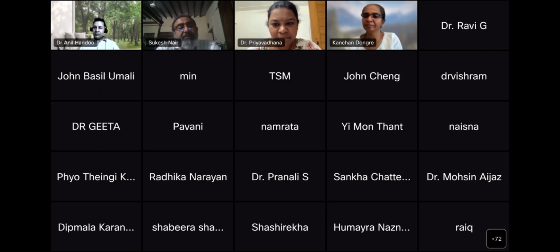If petechial hemorrhage is present in patients with thrombocytosis, yes, probably it could be. See, the other thing is, when you have thrombocytosis, please look at the histogram. If the histogram indicates platelet anisocytosis, that may be an indication that this is not reactive thrombocytosis, maybe a clonal thrombocytosis. But the data has to come on that. But if you have reactive thrombocytosis with ecchymosis, then maybe it's a good idea to look for von Willebrand's factor. Not only just antigen, but also a functional assay, because there can be loss of high molecular weight multimers when there is thrombocytosis.